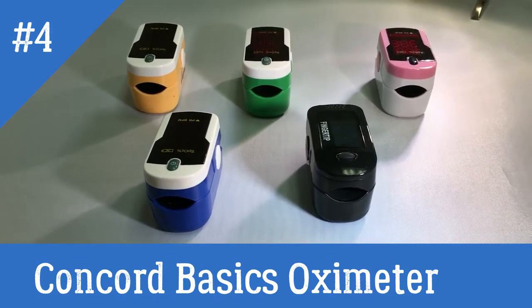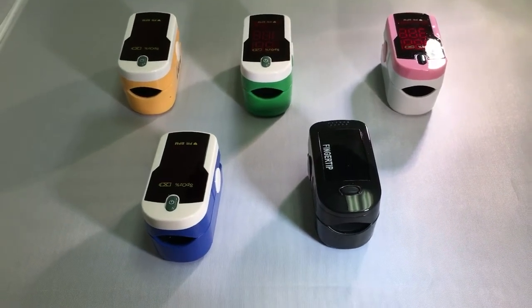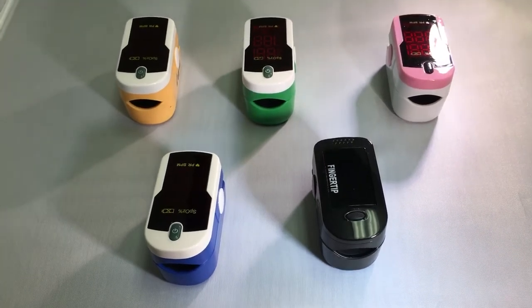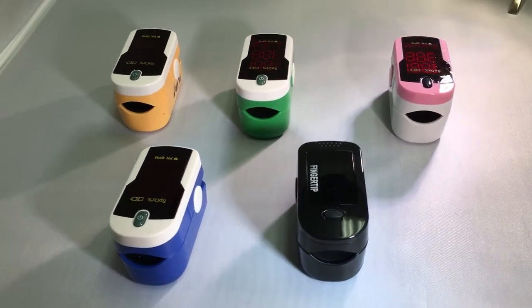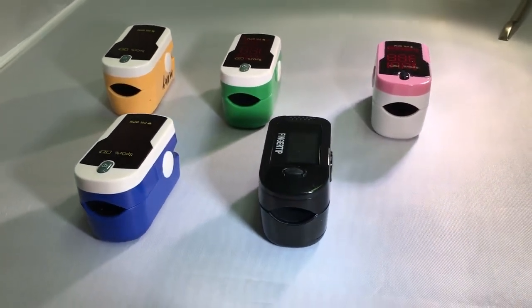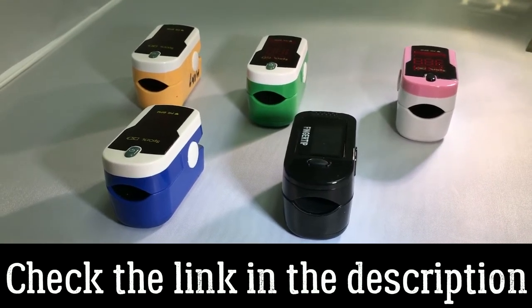Hi, this is KT from Concord Health Supply. In this video, we will be addressing the two different display modes for the Concord pulse oximeters seen here. The Topaz, Emerald, Pink, Sapphire, and the Black Ox all include a function which allows you to flip the display 180 degrees.